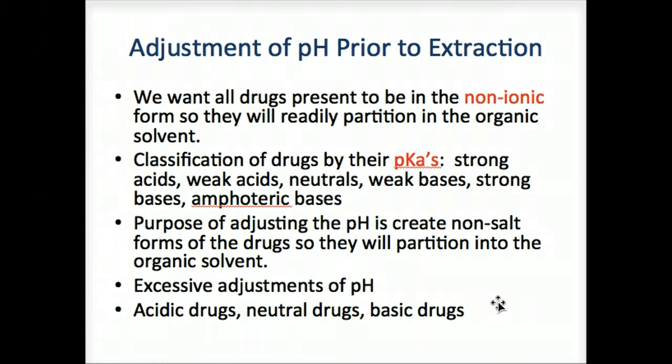Adjustment of pH prior to extraction. After a solvent is selected, then a buffer is added to convert any drugs present into non-ionic form so they will readily partition in the organic solvent. Carboxylic acids are fully protonated 2 pH units below their pKa's to keep them non-ionic.